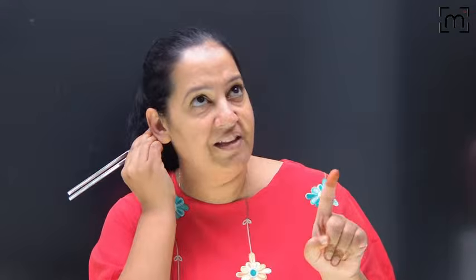So here we will take the tuning fork of 512 Hertz frequency. We will activate it and test BC. BC is shorter normally. And I'm here feeling the vibrations. Once I stop feeling the vibration, I will immediately keep it here for AC. Still I can hear the AC. So normally AC is longer than BC and here also AC is longer than BC. So maybe I am normal or maybe it's sensorineural deafness. In sensorineural deafness, my cochlea is defective, but my conductive pathway is normal. So AC will be greater than BC. But suppose the result is like this. I'm activating it, I'm keeping it here, I can feel the vibration, I'm waiting for the vibration to end. My vibrations have ended.